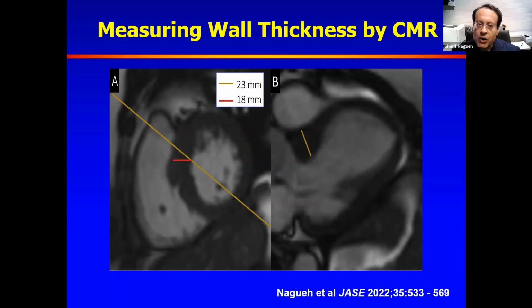In general, we start with echocardiography as the first imaging modality. Sometimes we see an abnormal EKG and an echo that appears normal, or you are looking at septal thickness that is borderline. For example, something that is maybe 14 millimeters or 12 millimeters in somebody with a positive family history. In these cases, one should have a lower threshold to proceed to CMR, which has solid spatial resolution.